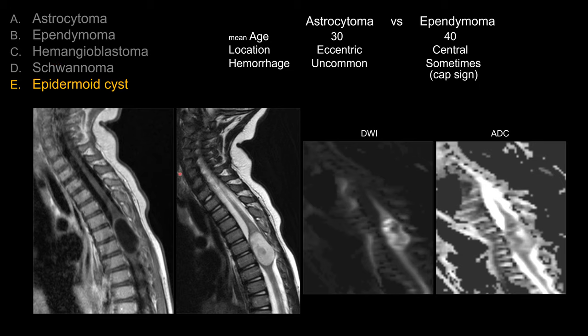For hemangioblastoma, they do present as an intramedullary cystic lesion, but classically they should show an enhancing mural nodule, which we don't see in this case. With hemangioblastoma, there is also an association with von Hippel-Lindau disease.